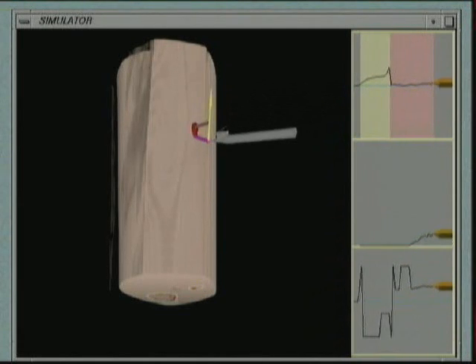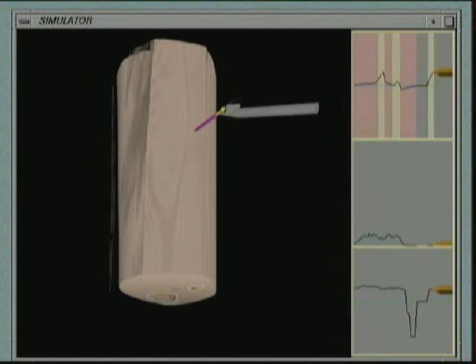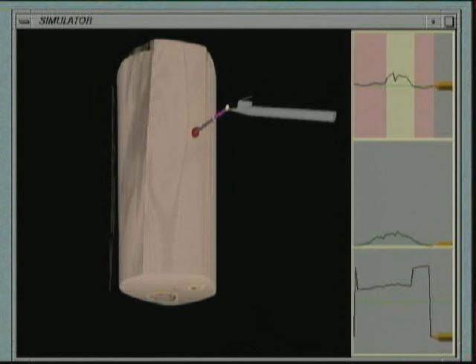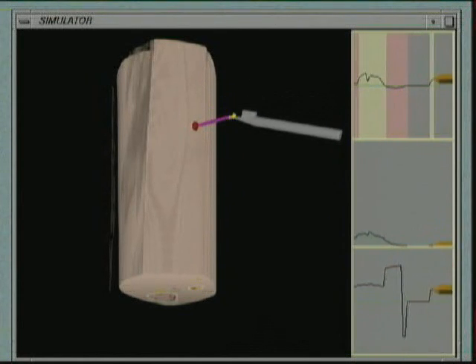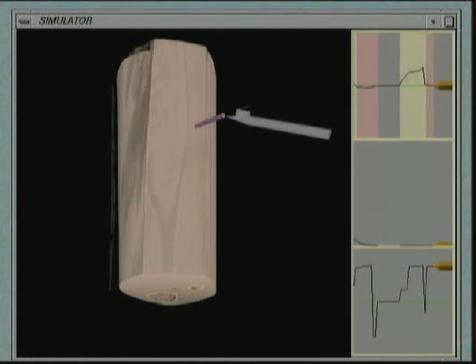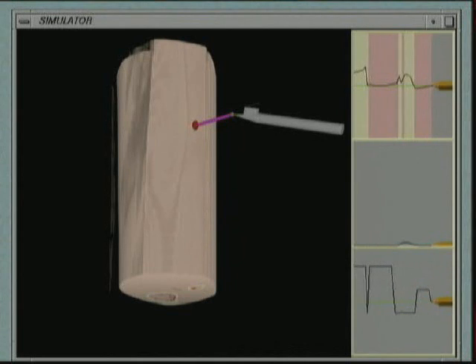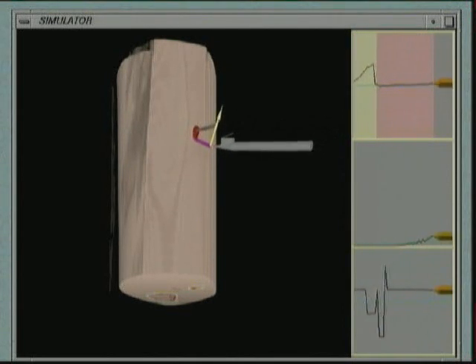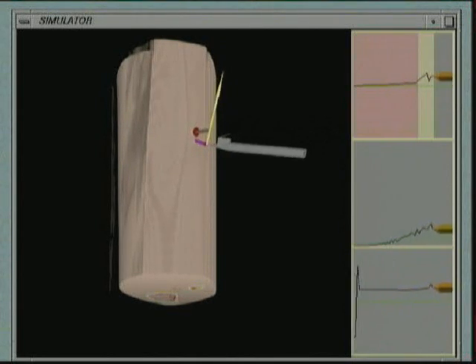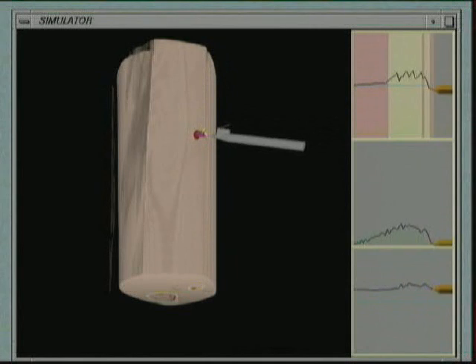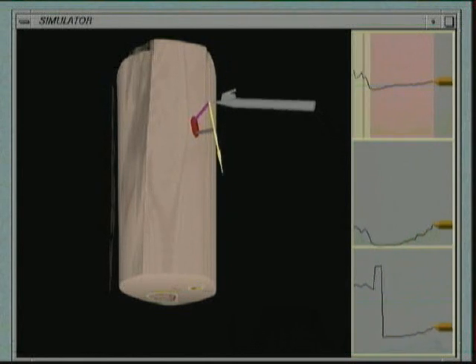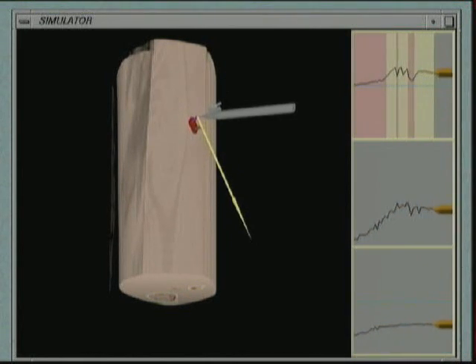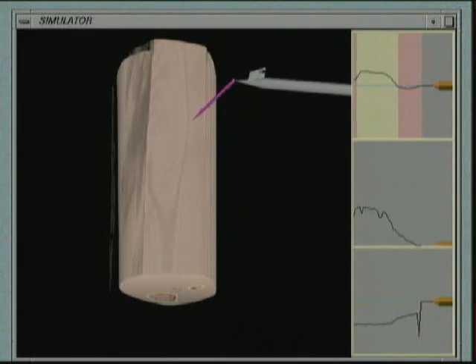Reaction forces are referred to the needle end point and applied to the phantom arm. If the axial component is greater than the static friction threshold, the system calculates the amount of needle slip within the tissues and updates the position of its equilibrium copy.